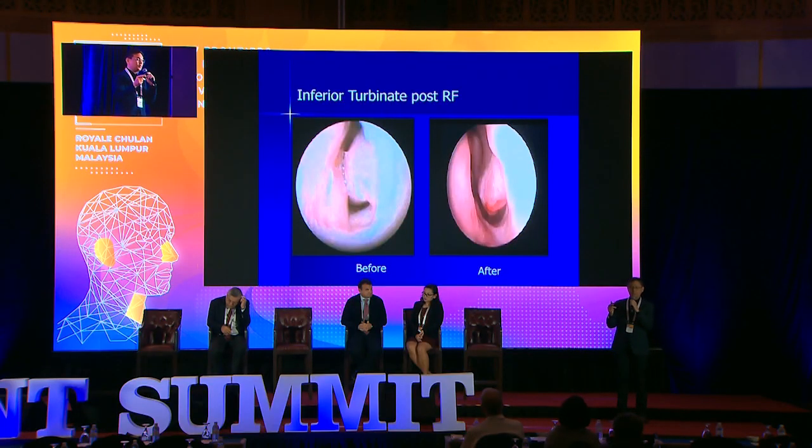You want to look at the deviation, you want to look at the polyp, use the endoscope, okay? And when I actually do radiofrequency in the clinic, which is quite often in a week, you can see the turbinate shrink real time, and when you're done with it, all of a sudden the patient says, I can breathe. And so this is endoscopic or even just direct by using a nasal speculum. But of course, it's more dramatic if it's by direct nasal endoscopy.